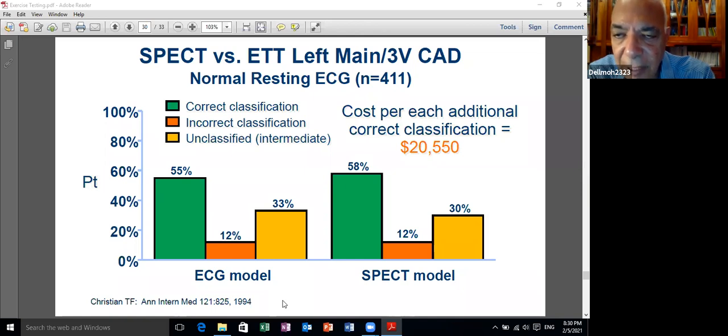عمرنا ما شفنا من دول اريزميا. هو كان بيدعي ان العيانين بيموتوا صدري من كده. طبعا زي ما انتم شفتوا بعد كده في عشرات السنين ما فيش عيانين بيموتوا لانك بتنيمهم. العيان اللي بيموت، من 1.5 مليون بيموت على التريدميل، ما بيموتش لما بينام.